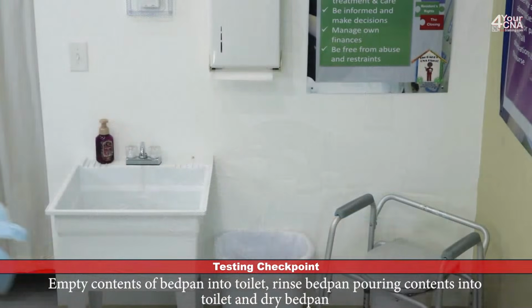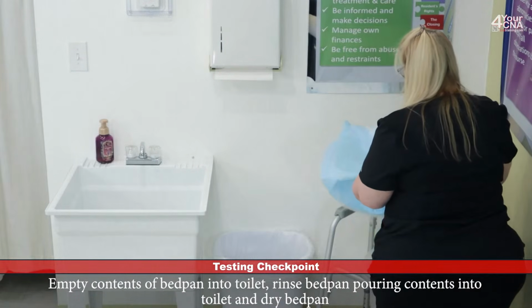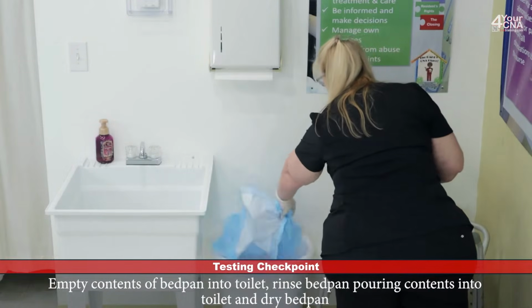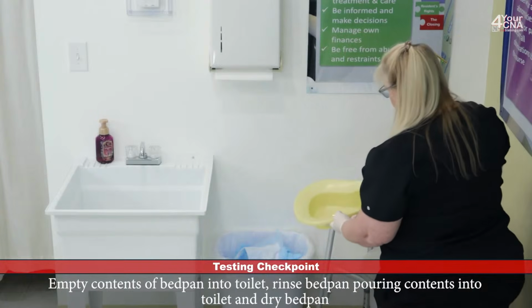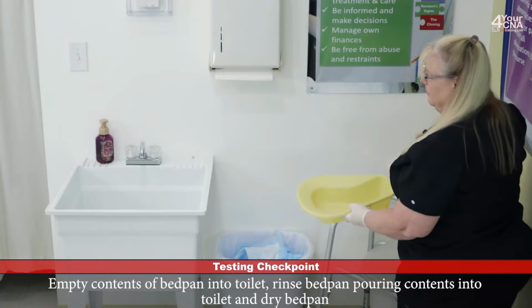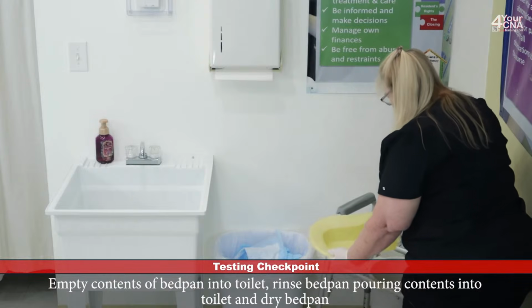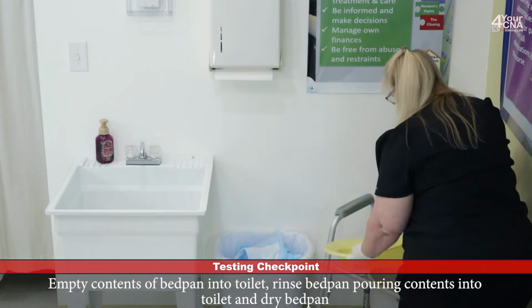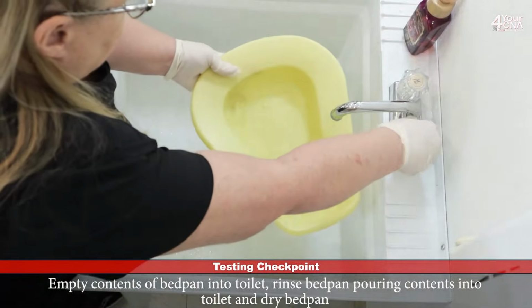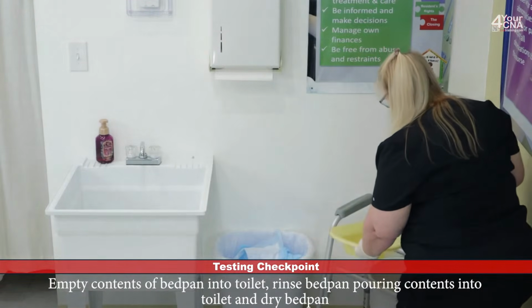I'll bring the bedpan over to the patient bathroom area. We'll unwrap the chucks from around the bedpan and dispose of the chucks. And then we're going to dispose of the contents of the bedpan into the bedside commode. For testing, this is a simulation skill. There will not be anything in the bedpan, but we're still going to follow through with the simulation. We'll lift up both the seat and the lid. We're going to dispose of the contents of the bedpan into the bedside commode or toilet. And then we're going to rinse the bedpan. We want to put the rinse water into the commode as well.